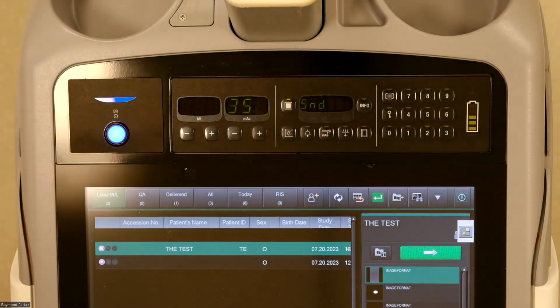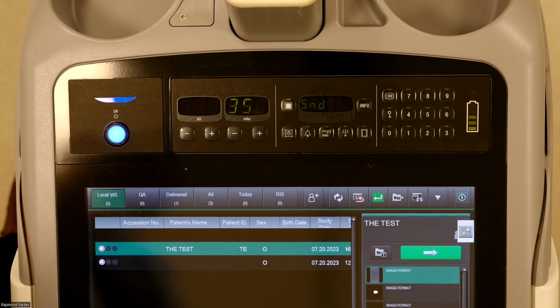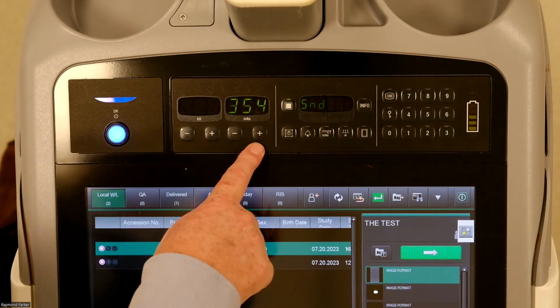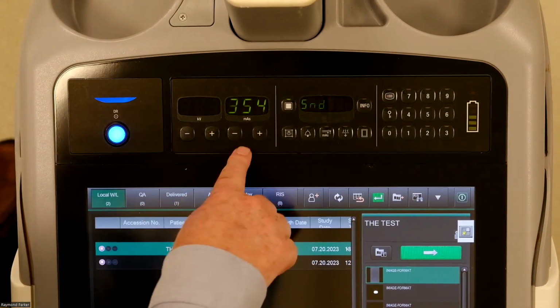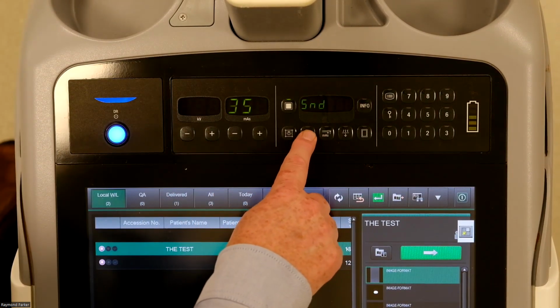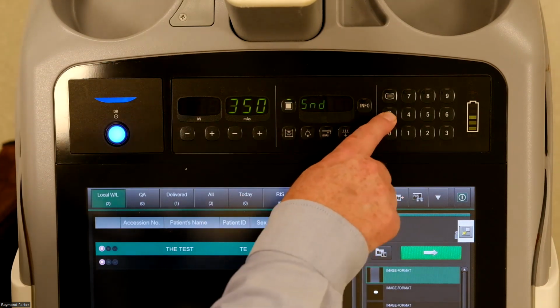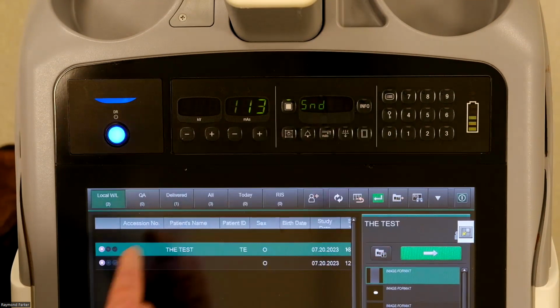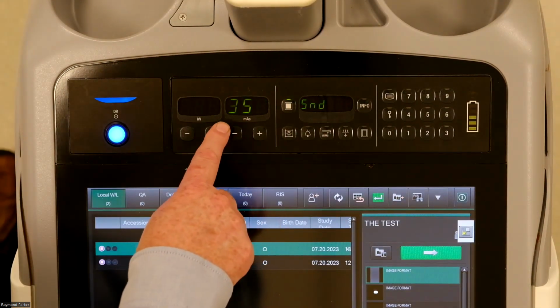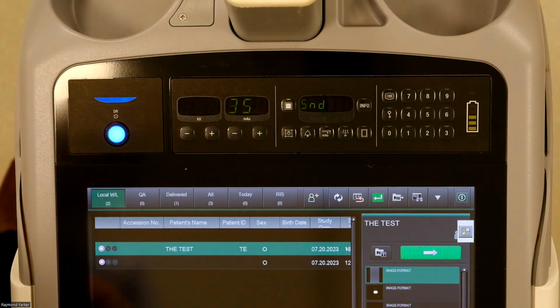So if you find a unit, you start to drive it and hear a travel beep. Most customers do not like that travel beep. So I would enter the user settings, come here, hit my bell till I see a 0 in that third entry, and then I will key that in. Once that is set, we should not have any sound while traveling.